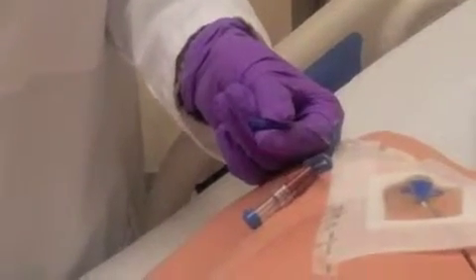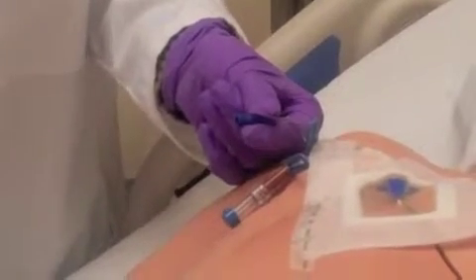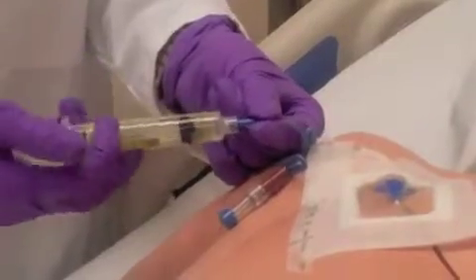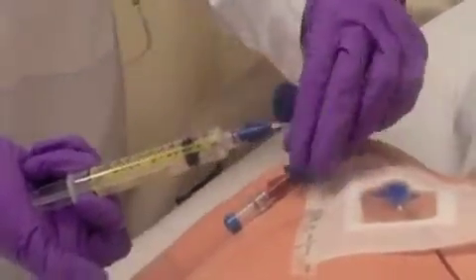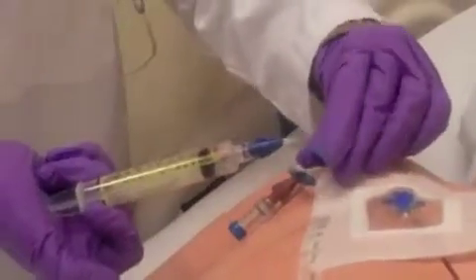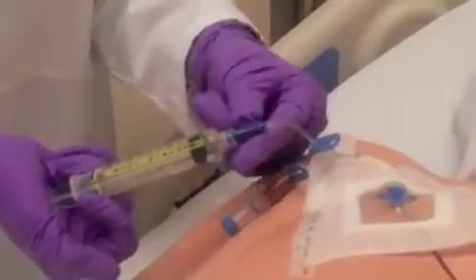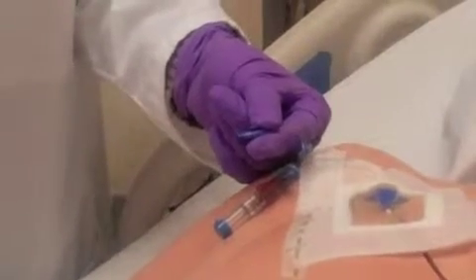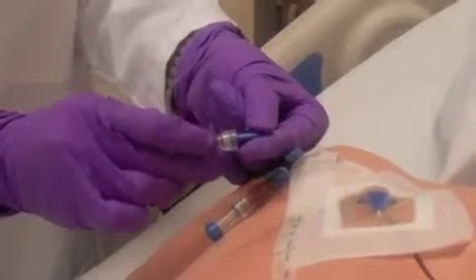You then flush with 3 milliliters of heparin, also using the pulse pause technique. You would apply a new sterile cap to the line.